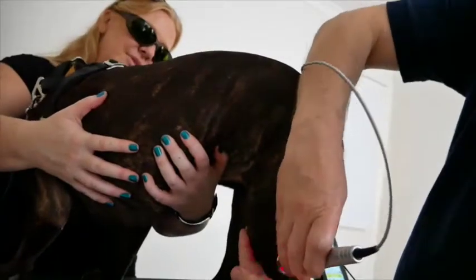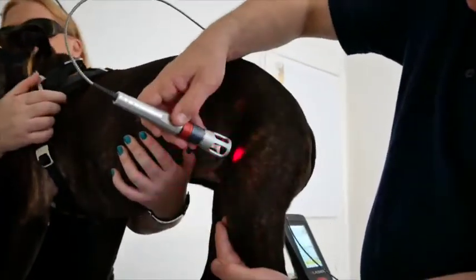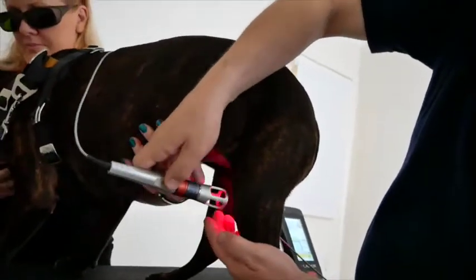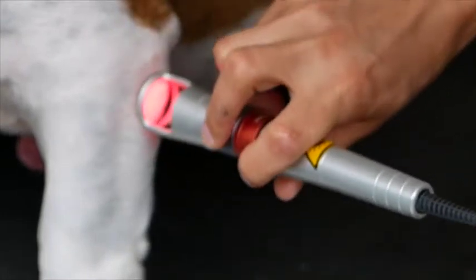For me, the biggest thing that I've noticed is in the clients that are able to reduce the dose rates of non-steroidals. So we may be able to go on to alternate day therapy at the time of surgery, for which we charge a fairly minimal fee, and that is purely just to help wound healing over the incision site. So that is one thing.